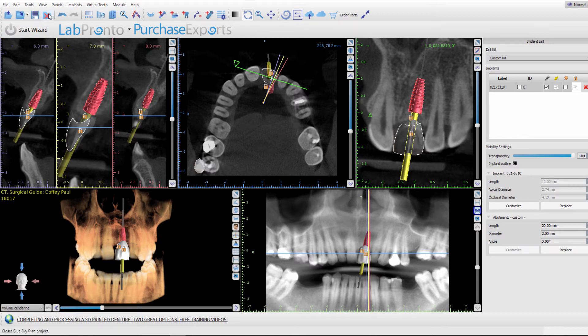In this video I will show you how to turn the closed section projection line and dental curve on and off.